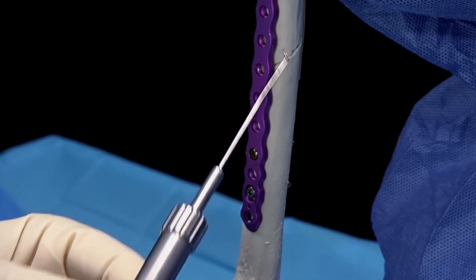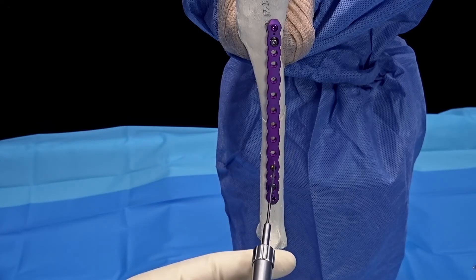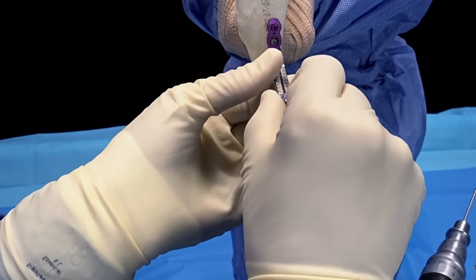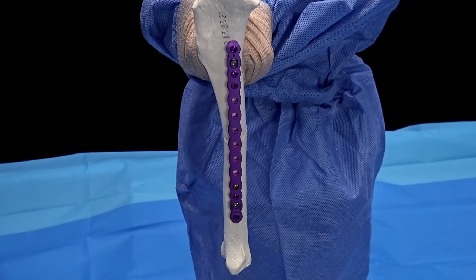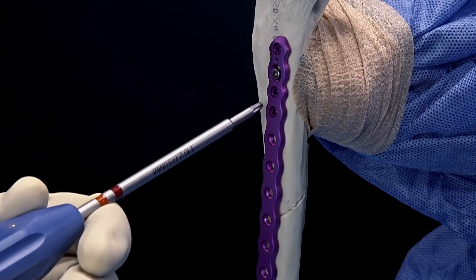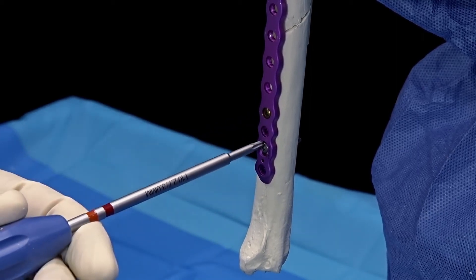In a fracture configuration such as this, when we have one millimeter or less of a fracture gap and we've compressed, two to three bicortical screws can be placed. When a bridging plate is used, three to four bicortical screws are recommended. In this case, we're going to place four screws proximally and four screws distally because we have the bone stock to do so. This concludes our repair of a mid short oblique diaphyseal tibial fracture using the 3.0 Arthrex OrthoLine plate, with four bicortical screws placed proximally including three locking screws and one cortical screw, and two locking screws placed distally as well as one variable angle locking screw and a compression cortical screw.